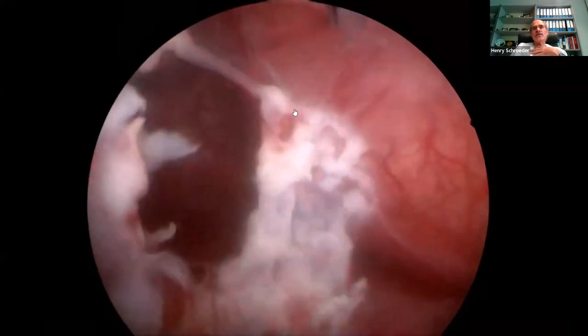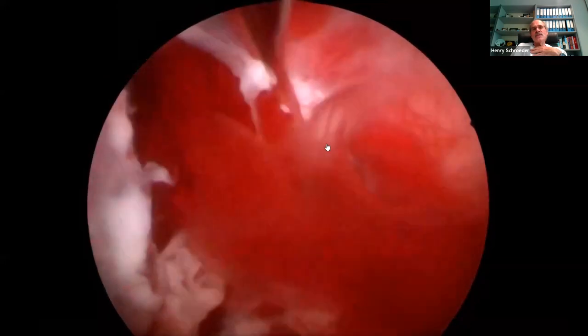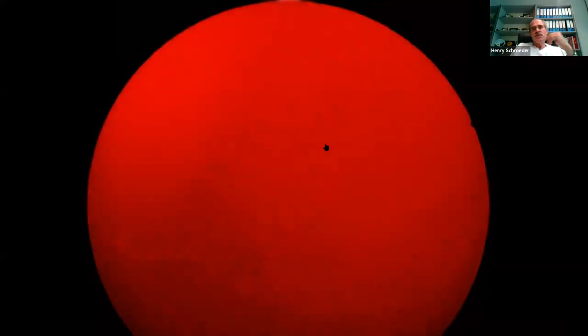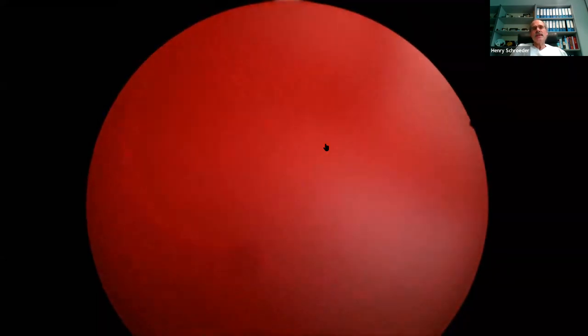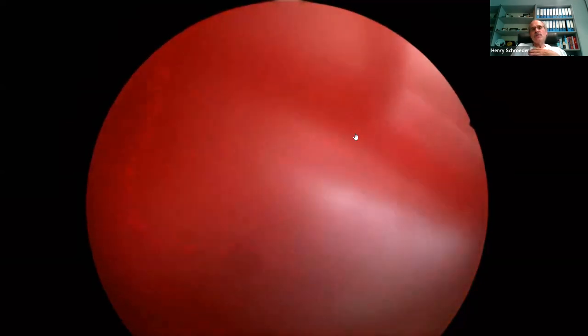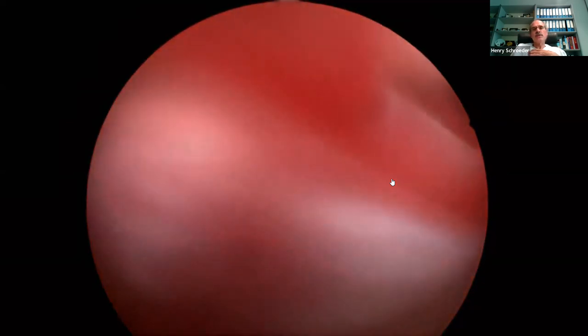You see this is an arachnoid cyst, and I cut; it was not very overt that there is a small artery. You see, this is a very tiny artery. In microsurgery, you would not recognize it. But here, with the underwater surgery, you have immediately the Japanese flag. You just see red. What you do now, of course, is start with irrigation, and then you get a glimpse of the anatomy. Then I go closer with my endoscope to find the bleeding point. This is not a vein, it's an artery, so it has to be occluded because it will bleed a long time.